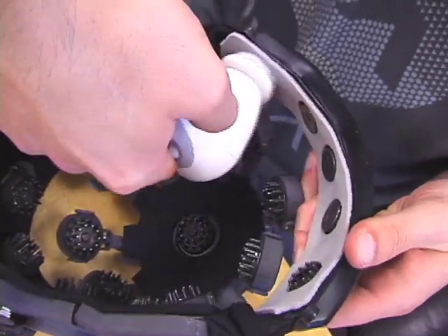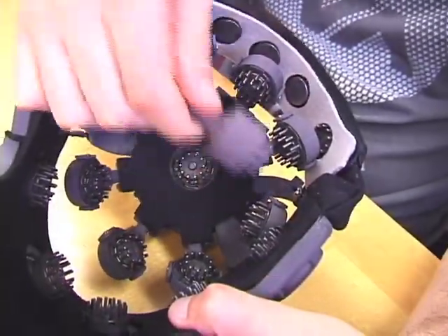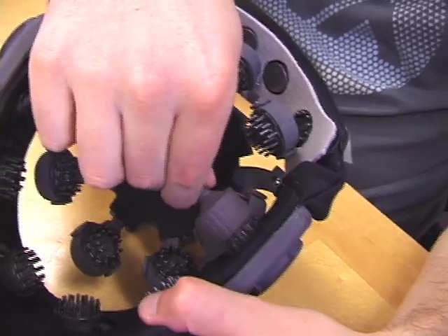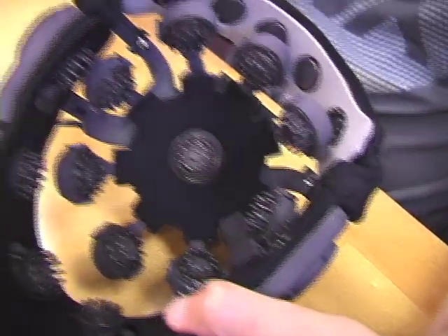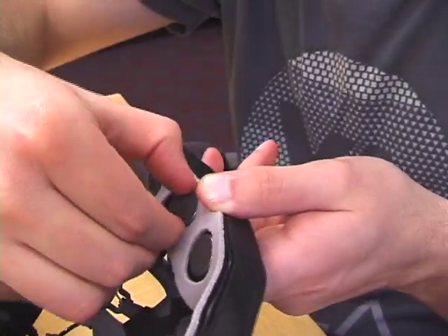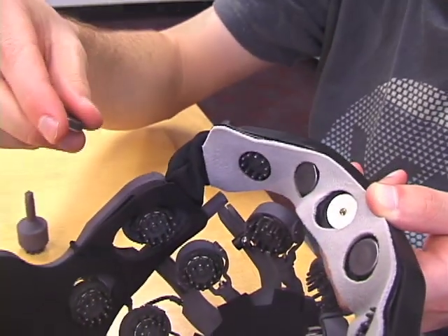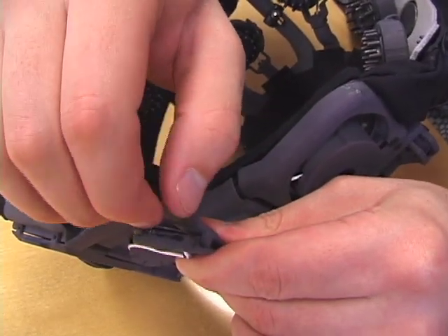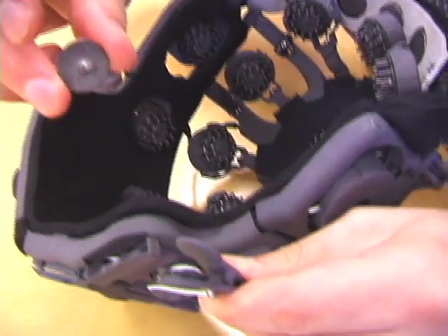Every six months or 100 uses, worn electrodes should be replaced. Electrodes with pins can be unscrewed and replaced using the provided tool. Flat electrode tips may be unscrewed by hand and replaced. The snap fit electrodes can be gently pried out by hand and new ones simply snapped into place.